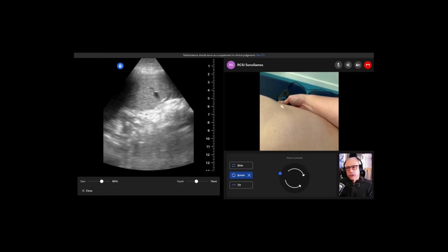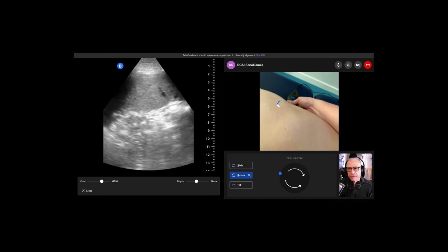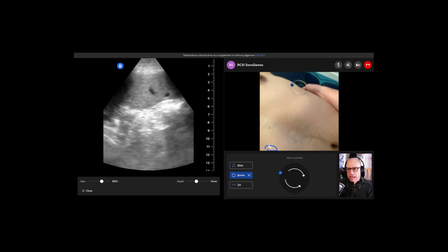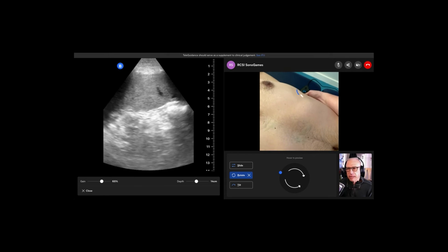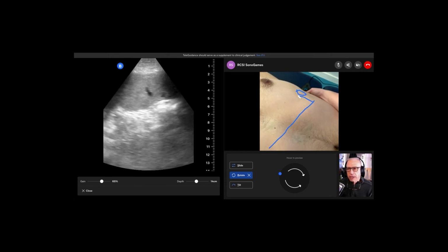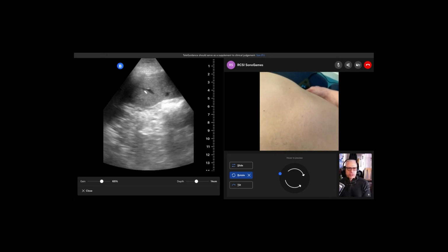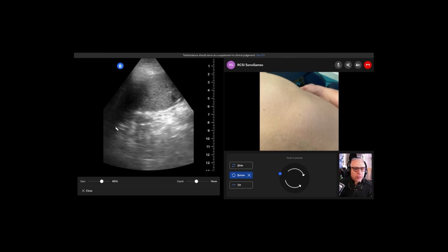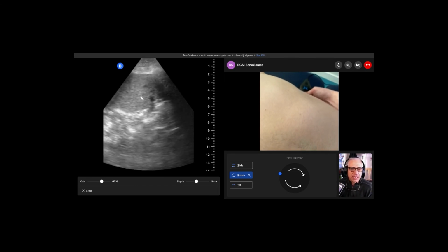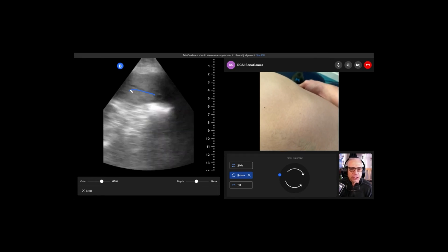One thing to remember, and I can't see the entire body here, but if your kidney is over here on the right side, the left is going to be more towards the head. So if you do an imaginary line, you have to slide up to get the spleen over here. So there's beautiful spleen. And what you want to see on the left side, to really be sensitive for blood, is to see spleen and diaphragm. So slide up one more rib space. Go this way still.